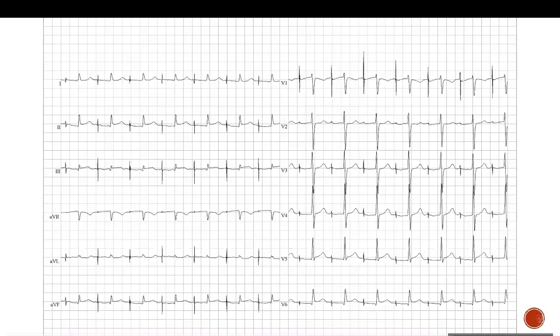I don't know. So okay. Do you think it's conducted? Yes. Okay. So here, this is the trick. You don't see a very nice P wave. But after every single beat, there is a fixed AV delay and there is a QRS. Right or not? It seems that the QRS is happening at a regular interval after the paced beat. Right?